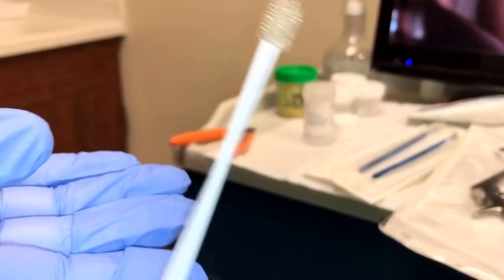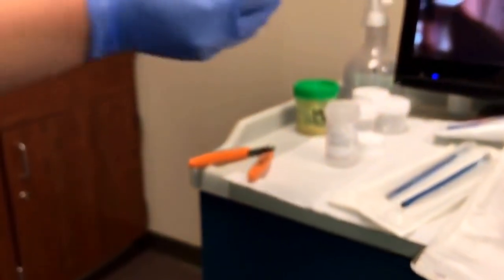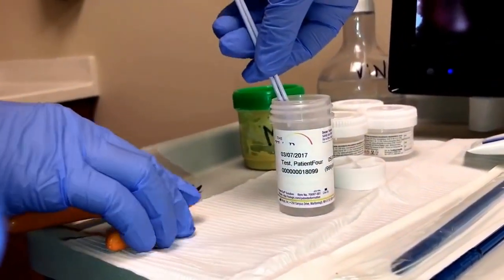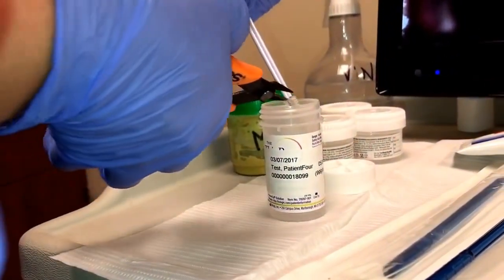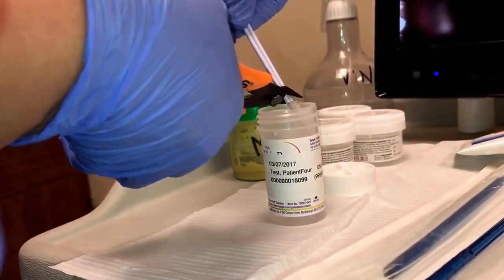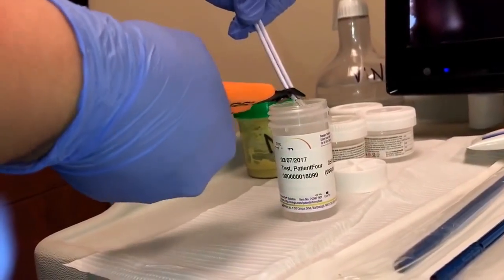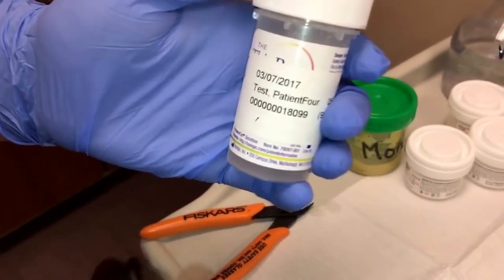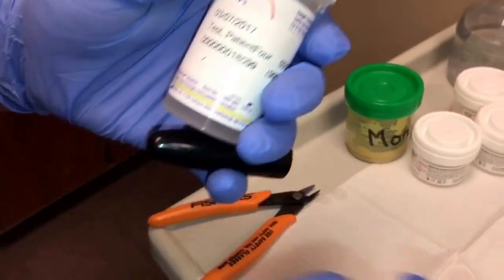After the ECC biopsies have been collected, they will be passed to the MA, where they will be placed into the thin prep vial and then cut with the wire cutters. When that has been cut and the vial is closed, it will be labeled ECC.